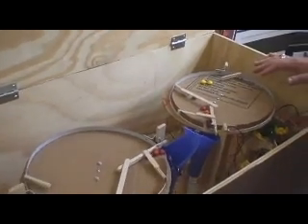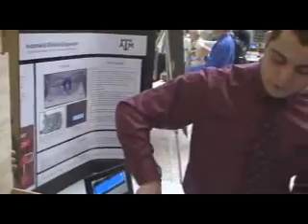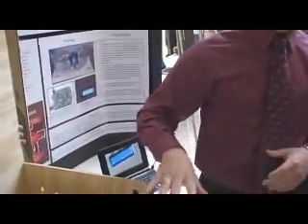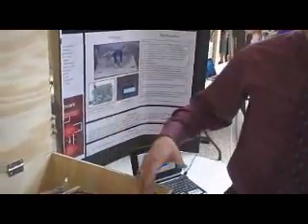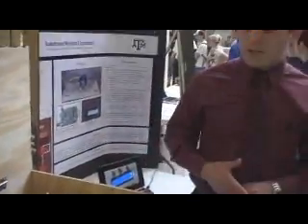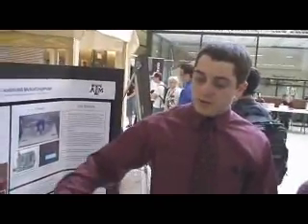That one has a little bit of an error. Sometimes we've been having some trouble with the motor shield, and you push the reset button, that turns off the alarm. We've been having trouble with the motor shield. Sometimes it's with the analog pin. Sometimes it's outputting high voltage. We never managed to fully debug that, but this one obviously worked pretty well. And this one it just applied a full voltage to that instead.